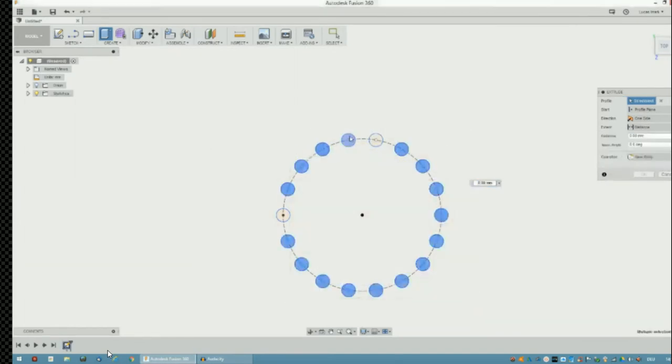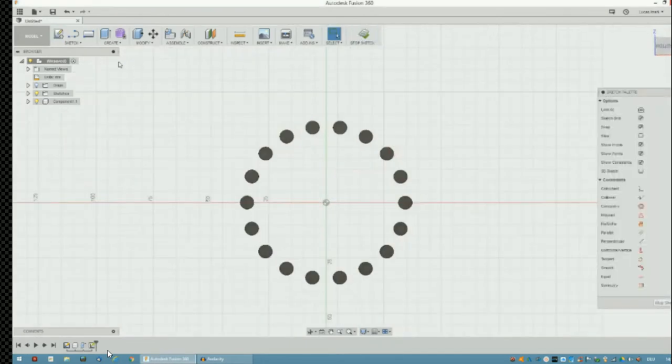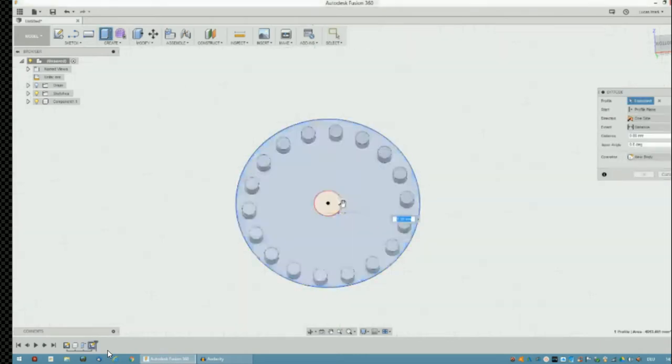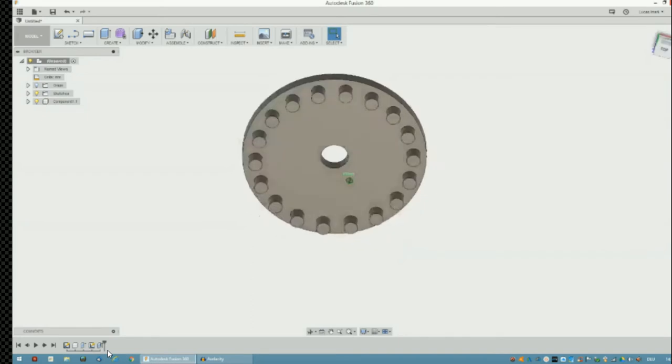Some problems choosing it all. So, yeah, take a random number. And make a new body, a new component, actually. And now you draw another new sketch and make the exterior disc random sized. Now I make a center diameter for the shaft to pass through and adding material. So that's the basics.